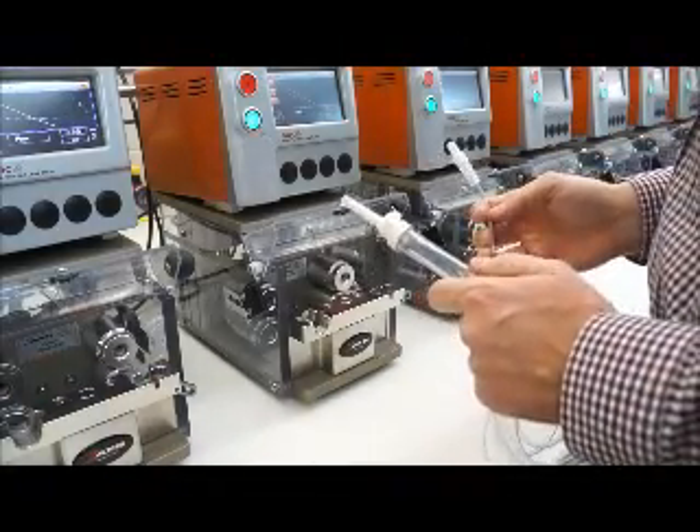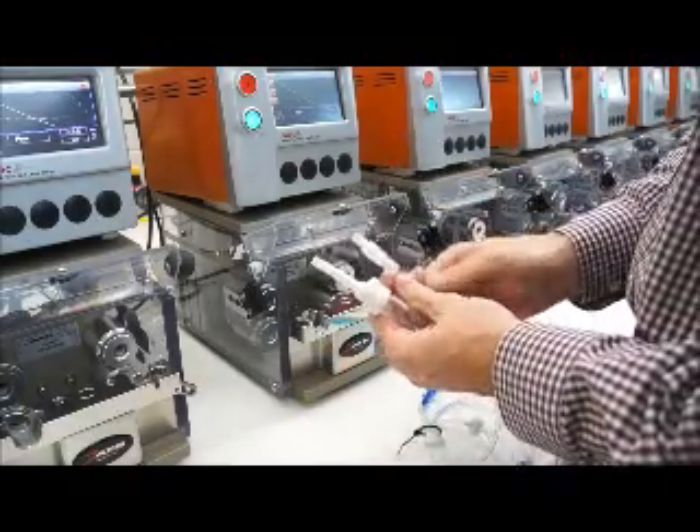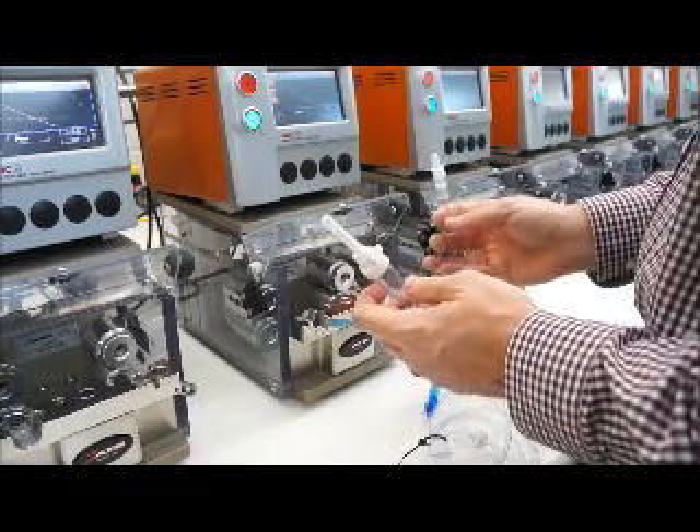We're doing a leak and occlusion test of an IV set. We're going to remove the caps from the bag spike and the lure, perform a leak test and then an occlusion test, and then replace the caps.